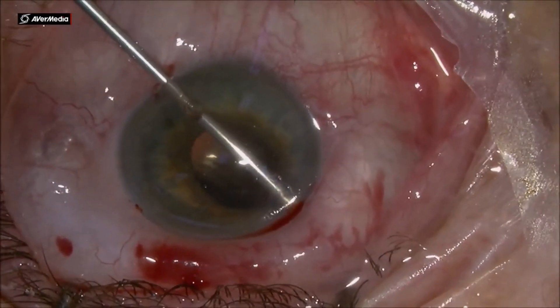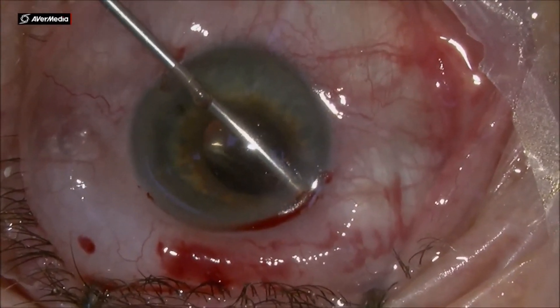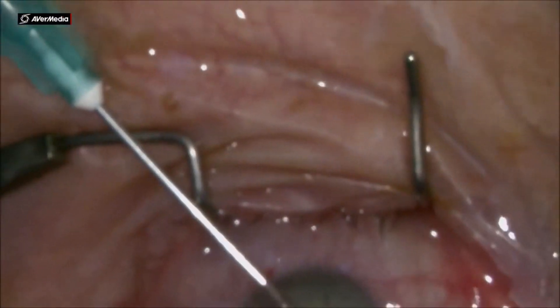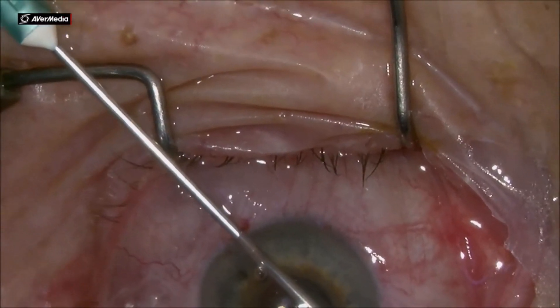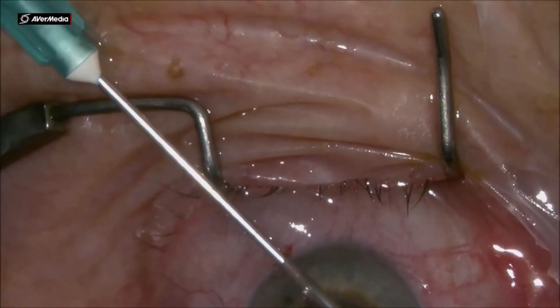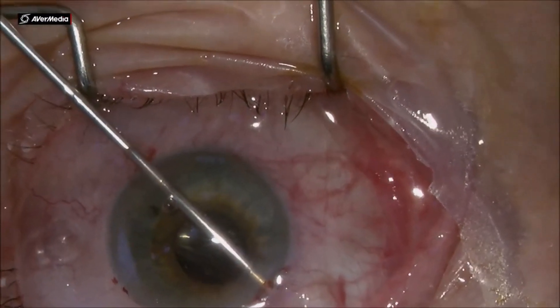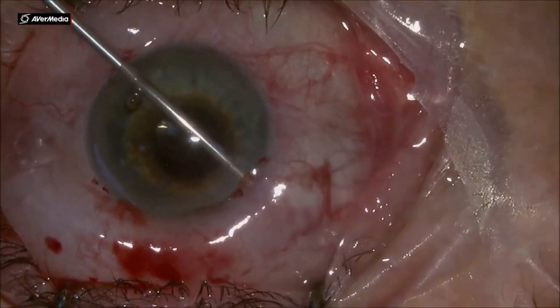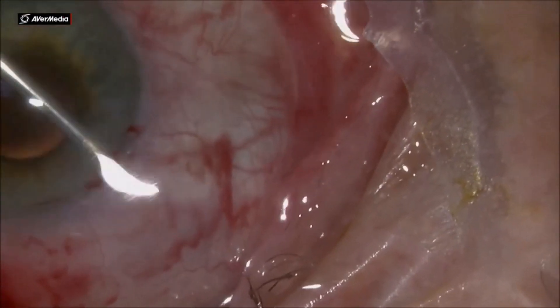In this case I used a 21 gauge needle. This patient had glaucoma before cataract surgery. The IOP was around 30, 28, 30 mmHg. You can see that I used the needle to go into the space — into the trabecular meshwork, in the space between the cornea and iris. By pushing and turning the needle, I create a tunnel — not just a cut, but a tunnel.